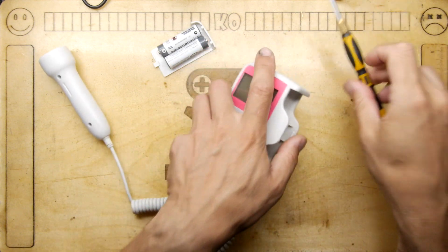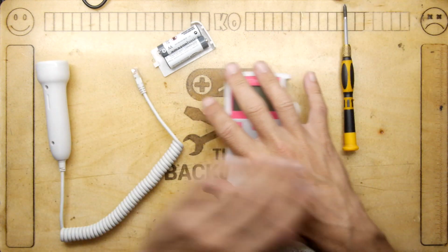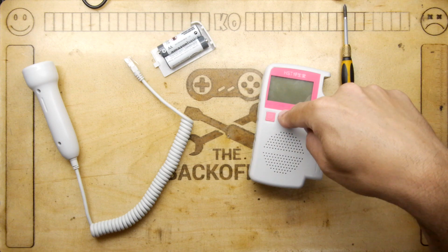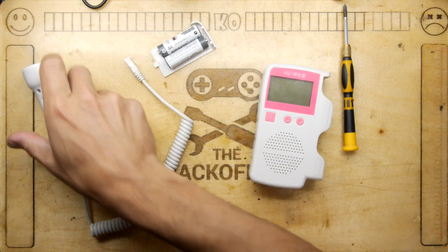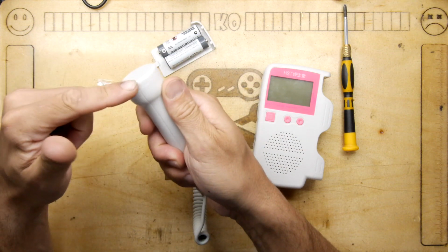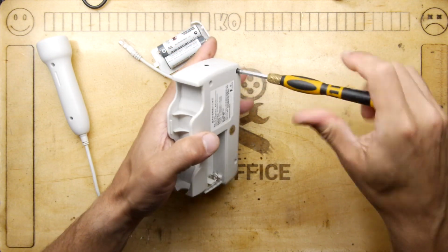But I thought it'd be curious to have a look inside it, and I thought I will make a prediction on this 50p purchase. There'll be a PCB in here with not much on it other than an FPGA or similar chip, and inside here I think it will look like a piezo speaker in that end. That's my prediction, but let's see, I'm probably wrong.